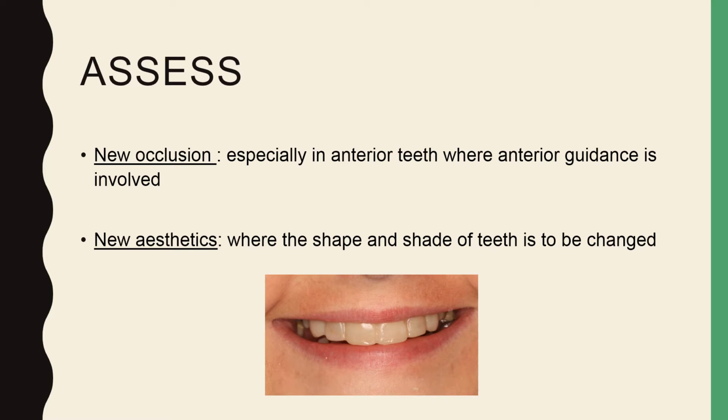A trial stage helps decide the definitive restoration's morphology, which is a good idea, especially if you have a picky patient. This photograph shows provisional restorations from canine to canine, which was used to decide the length and the shape of the teeth before going to the definitive restoration.